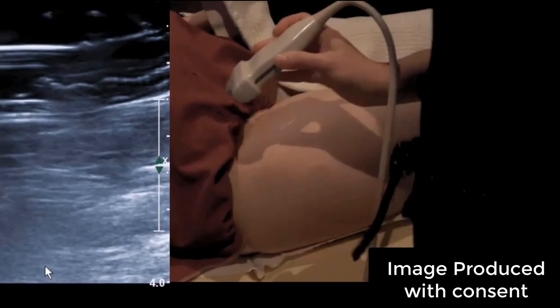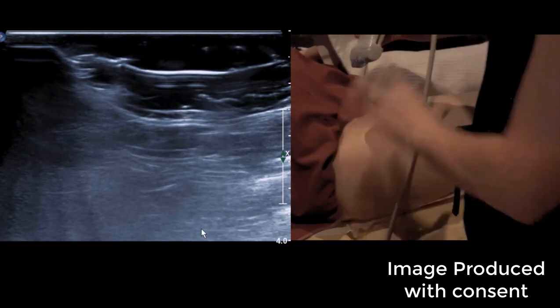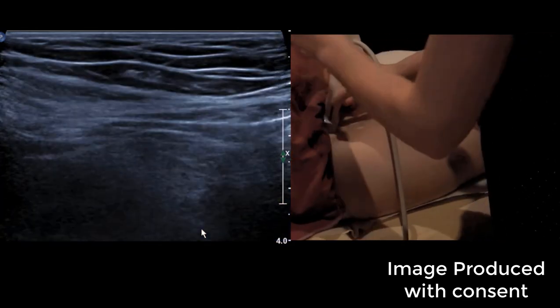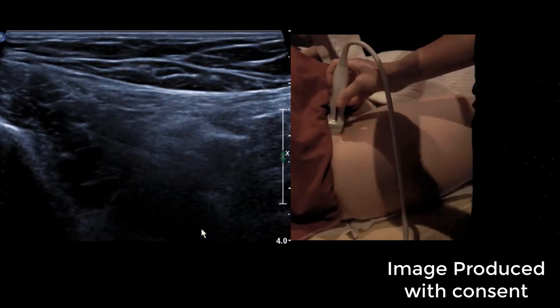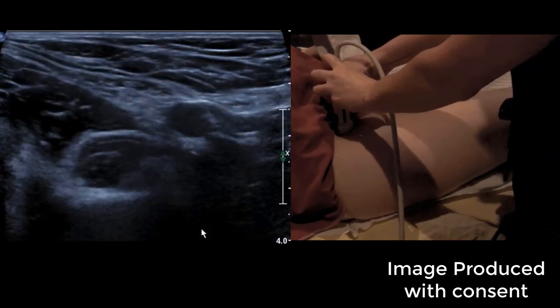So obviously your body needs to be high, because otherwise your elbow's just going to run into their leg. And left hips, if you've got a spare person to work the machine, just stand on the other side. I just pull it out from the wall. So it's a two hands job.